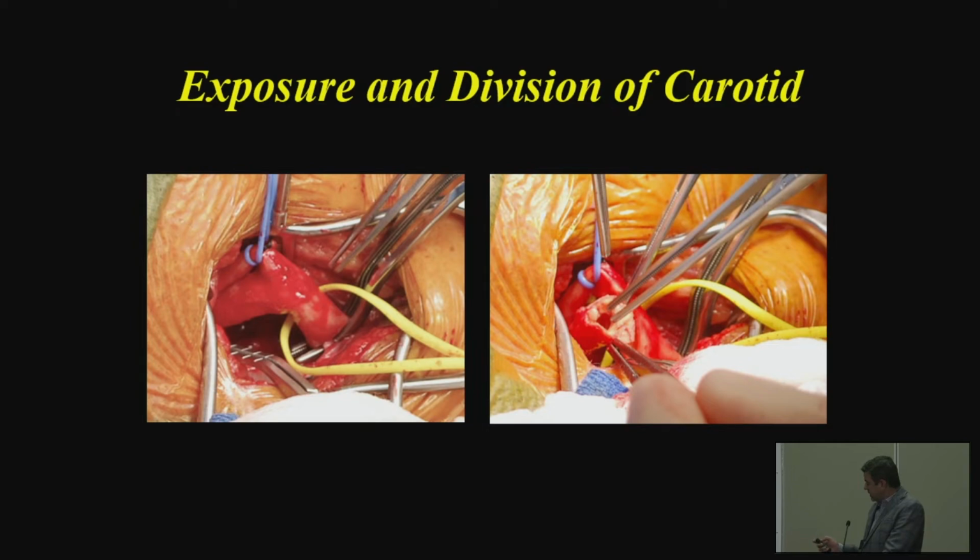And so we make a small incision, go down and encircle the common carotid here. The internal is right here, and this is the external with a little blue loop attached to it. And so that's the internal coming right there. So then we're going to divide that internal right here, which is, now you see the artery divided, and you can see the plaque on the inside.